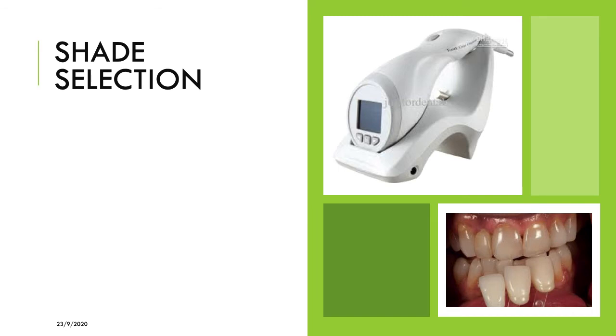That is about the shade guide. So it is always better to do it before the procedure. Tooth preparation is done, impression is taken, and shade selection is done. So the last step in the first setting is temporization.